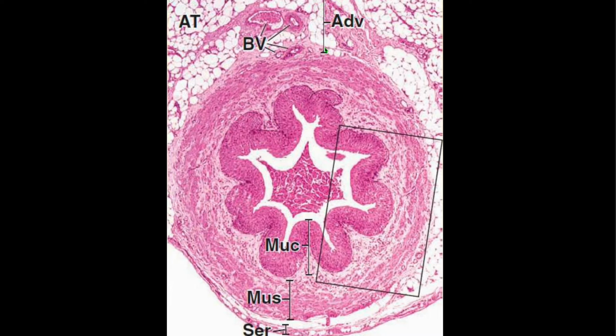You have to note that the ureters are located behind the peritoneum of the abdominal cavity in their course to the bladder. Thus, a serosa layer that is over here may be found covering a portion of the circumference of the tube. And also because of contraction of the smooth muscle of the muscularis, the luminal surface, which is clearly visible over here, is characteristically folded, thus creating a star-shaped lumen.